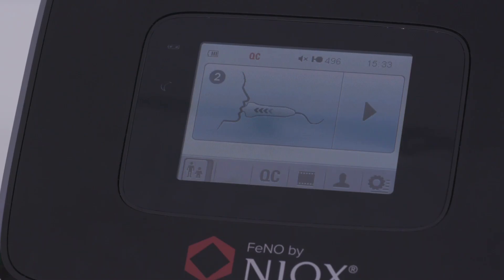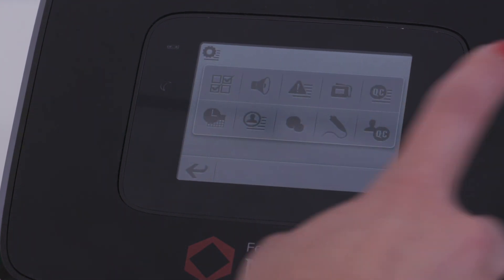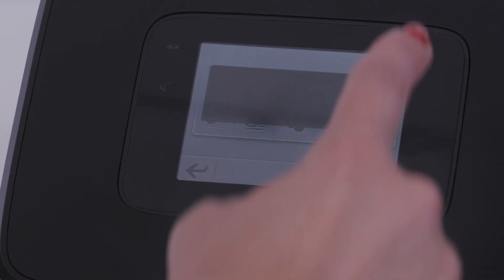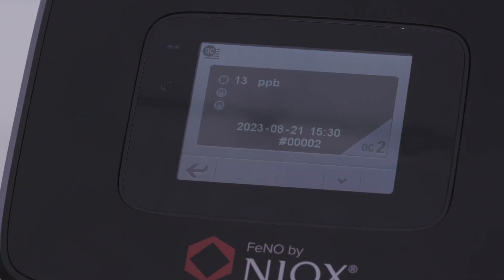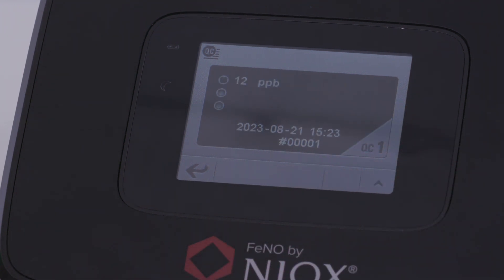Now that you've created a user and performed the measurements, you can view the QC measurements in the QC log. To access the log, select the settings icon on the home screen, then touch the QC icon with the lines. Use the up and down arrows to view previous measurements.